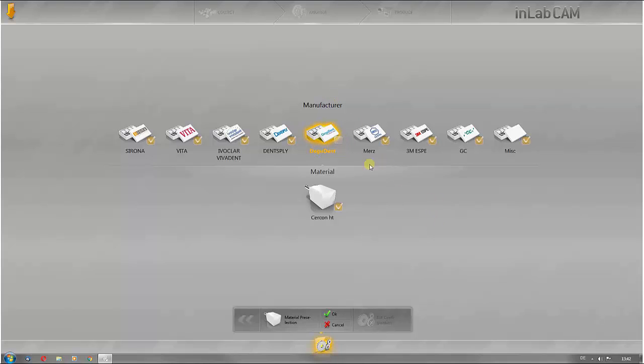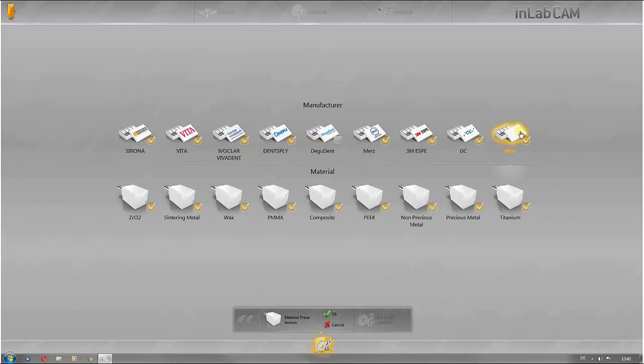As a result, these materials are no longer suggested in the material preview. It is recommended to leave MISC in the software as all materials are saved here which are not listed by Sirona or the material partners.